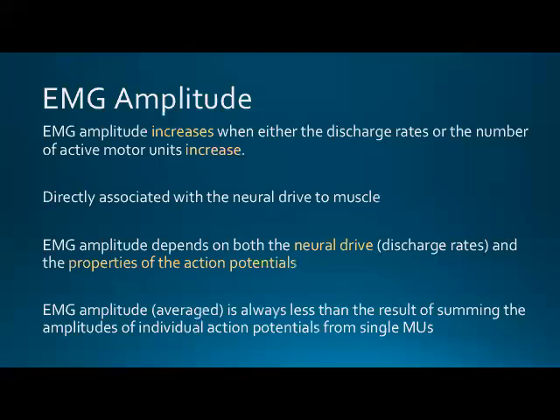So its application is really best if we're using a higher intensity contraction, so a greater percent of, say, your maximal voluntary contraction, greater percent of your 1RM, or doing some kind of fatiguing or longer duration task that will ultimately result in the usage of at least your intermediate and higher threshold motor units. But again, because it is a summated signal and it's not directly measured at the muscle belly site like the intramuscular would be, you will lose some of that fine detail from the low-level units. If you're only interested in low-threshold motor units, then the intramuscular might be a better way to go.